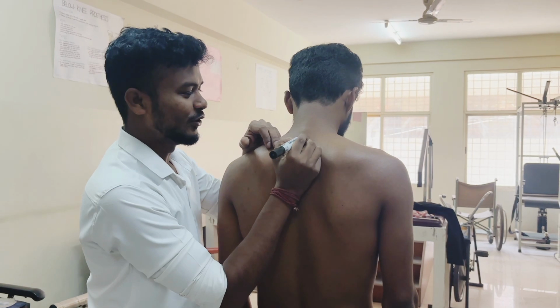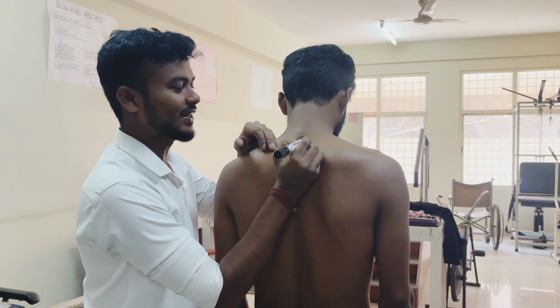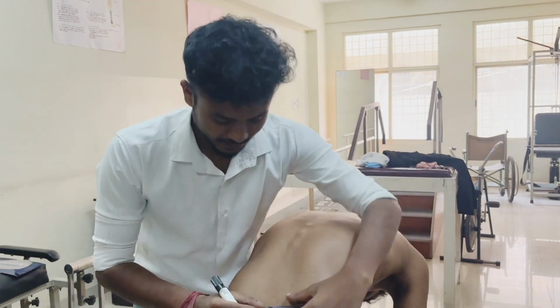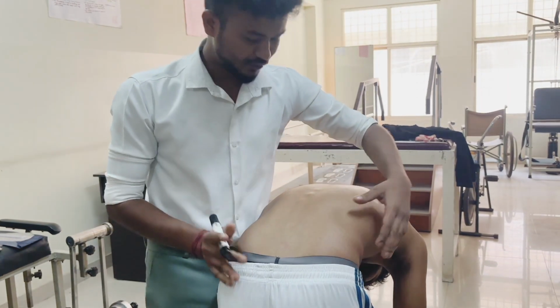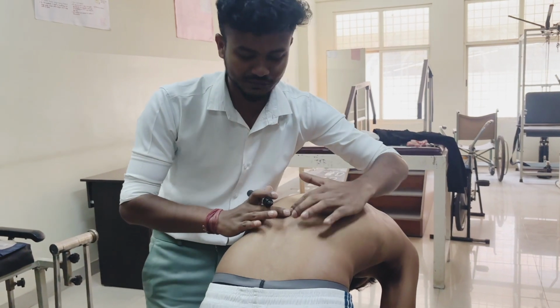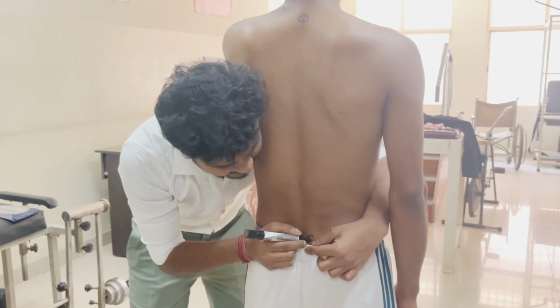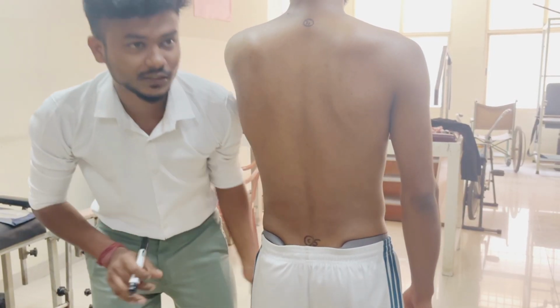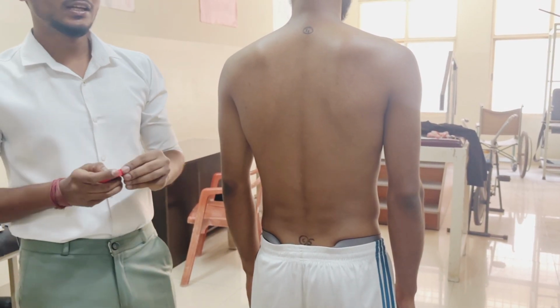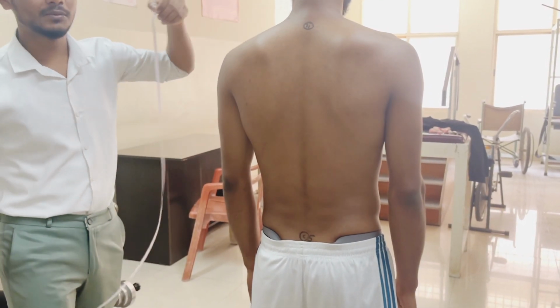So here we will mark T1. This is our T1 spinous process. After that we have to mark L5. L5 we discussed: from the rib cage we come to T12 and then come down. So these are our two marks, and we have to mark these two points. Now we are going to measure the thoracolumbar flexion.